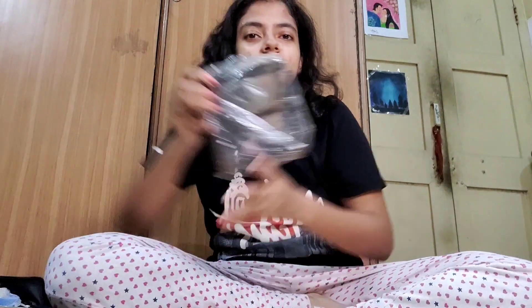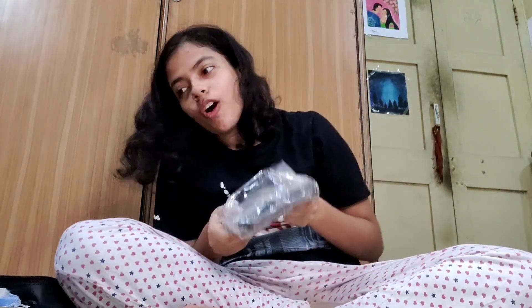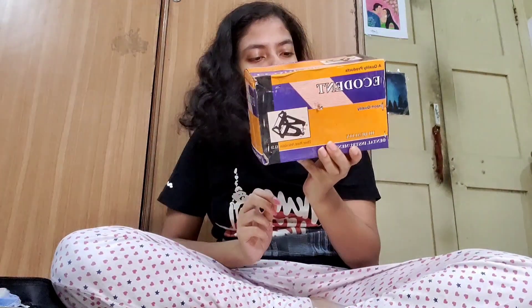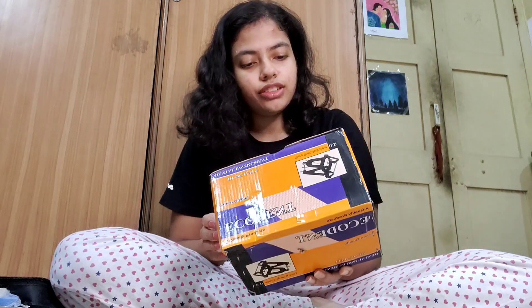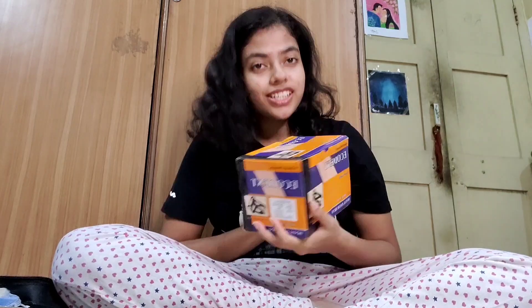Then we got this item, which I don't know what they call it, but we'll know by the end of this video because we are going to find out the names and functions of all these things. So next we have this thing called Ecodent, which is written as a three-point articulator. We are going to find out its function as well, so stay tuned.